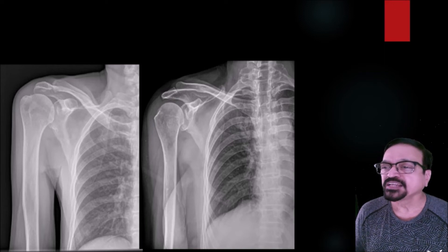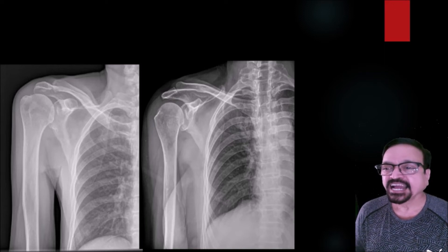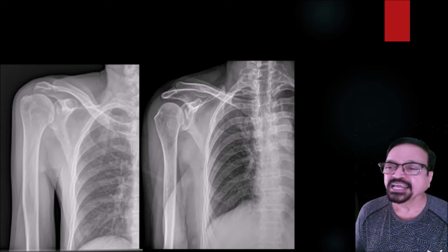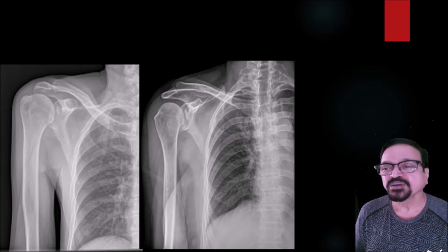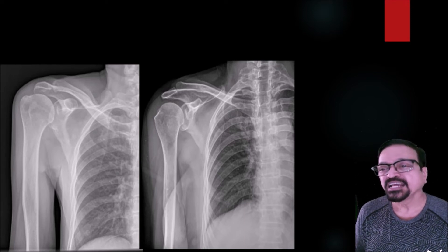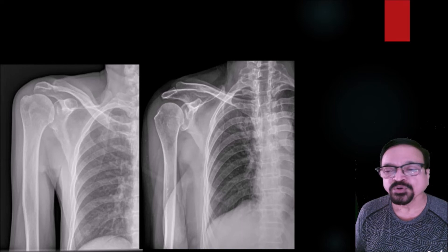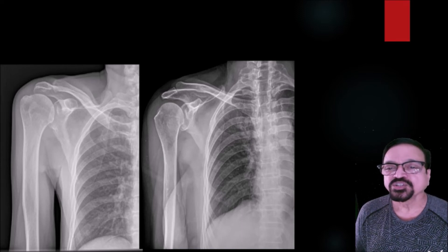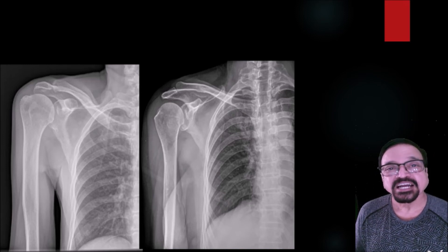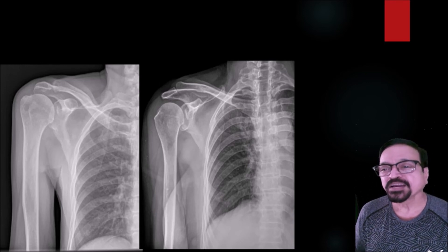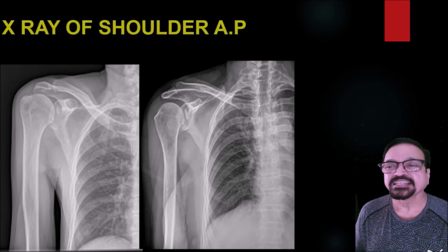The second projection includes the cervical spine, as there is an obvious pathology of the cervical spine present. This is not a standard technique but it can give useful information. Similarly, if you want to assess the clavicle — especially when suspecting trauma or if the patient has pain — we try to include that part in the radiograph, using a Bucky or a larger cassette. Whenever such additional pathologies are detected, the patient is referred for specialized X-rays. For bony cervical ribs and the clavicle, there are special views which will be covered in different lectures.